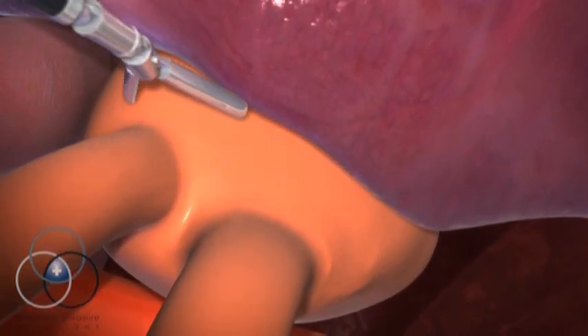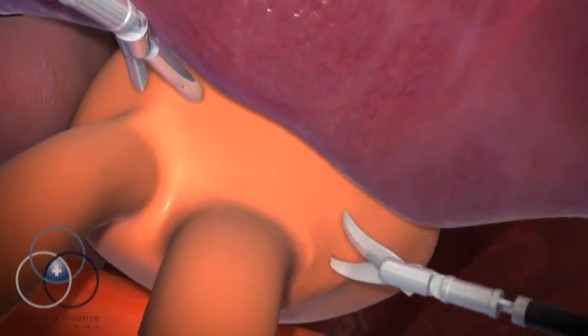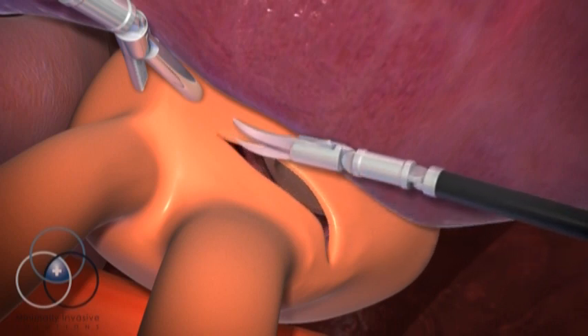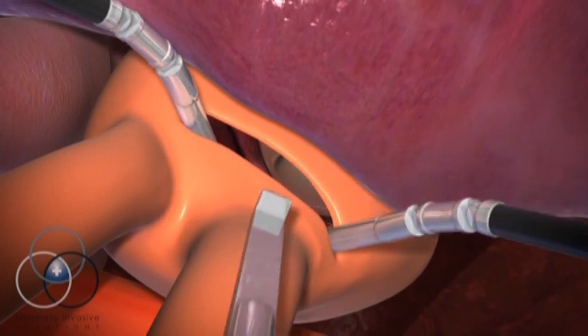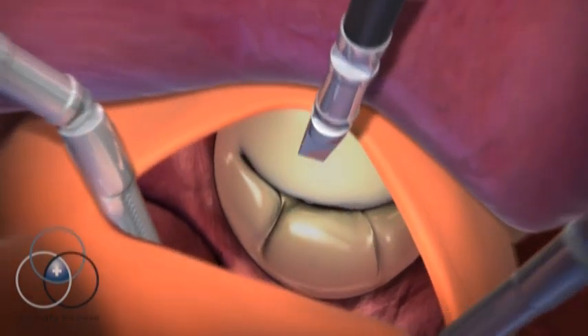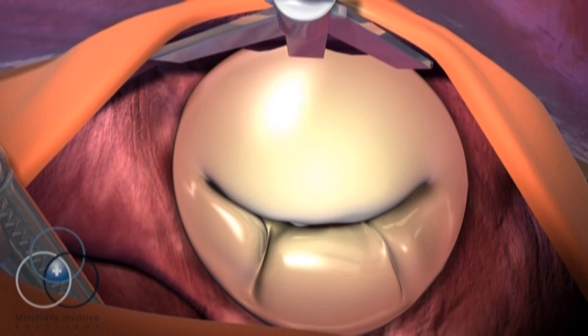Once the heart has been stopped, the surgeon creates an opening in the left atrium to gain access to the valve. Using the third instrument arm, the surgeon lifts the roof of the atrium, exposing the mitral valve and the supporting structures.